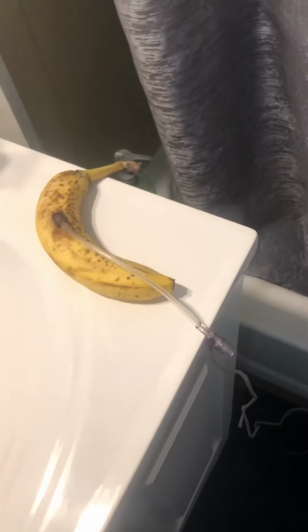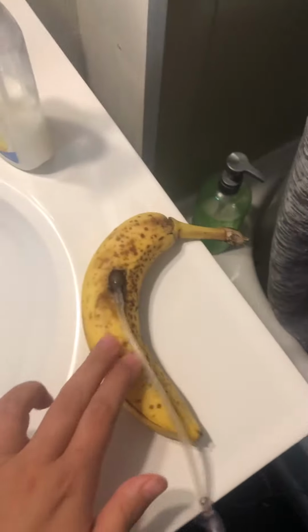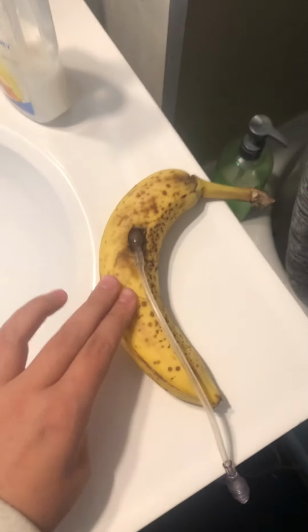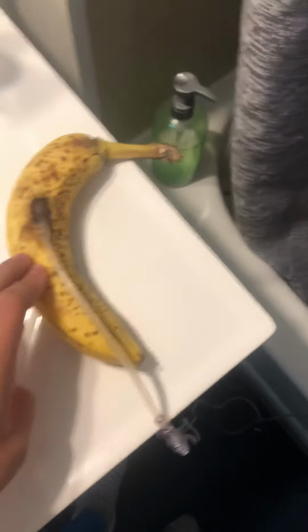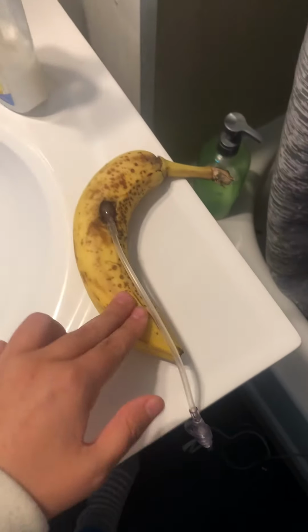Okay, so I'm just going to check what's running. So I see that you have D5 a half normal saline running at 80 milliliters per hour. Your tubing looks good, not kinked. I'm going to check your IV site. I already washed my hands. Okay, I washed my hands. There's no kinks in the tubing. I see the site looks clear, not swollen, not red, not tender. There's no leaking. Everything looks good.